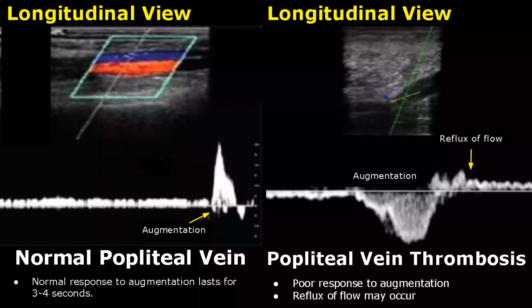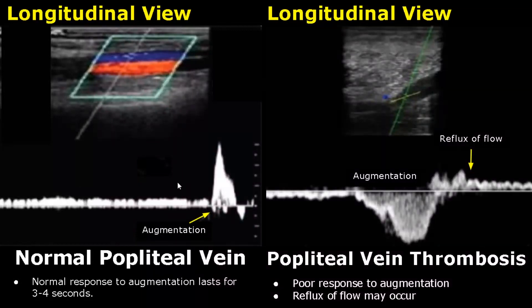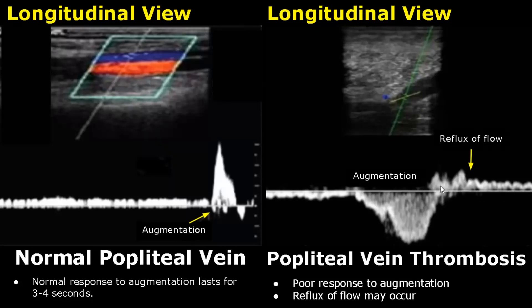With the help of spectral Doppler, flow in the popliteal vein can be further evaluated by checking the response to augmentation, which is done by squeezing the calf distal to the site of scan. Normally this response lasts for 3 to 4 seconds, after which the flow returns to normal. But in the case of thrombosis, there is a poor response to augmentation. We can actually see reflux of flow here — the blood is going in the opposite direction. The flow is seen above the baseline, whereas it was below the baseline prior to augmentation.